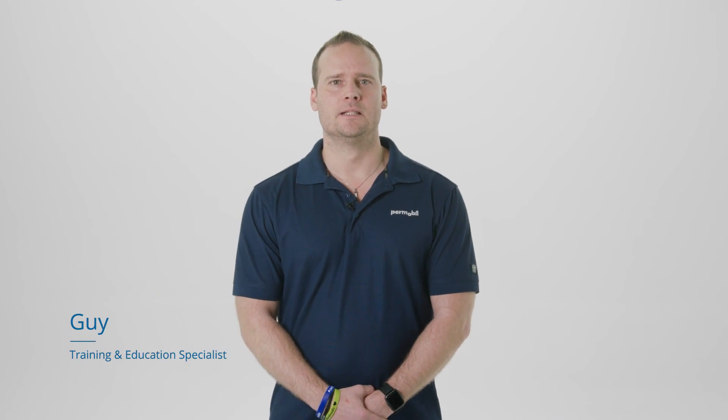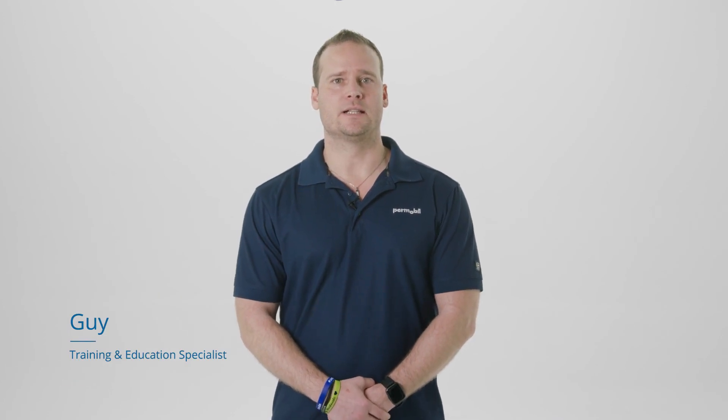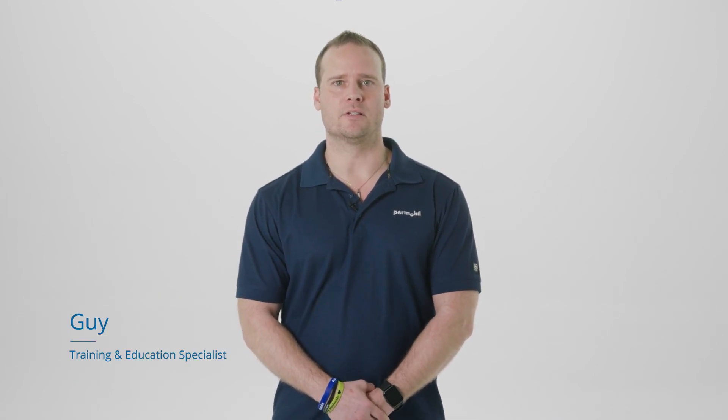Hi, this is Guy from Permobil. Keeping your wheelchair and its accessories clean and disinfected is an important but often overlooked part of routine maintenance. It can help ensure your products look good, continue to function well, and most importantly, it can help to limit the spread of bacteria and viruses. Today we will take a look at how to clean some of the most common Permobil products.